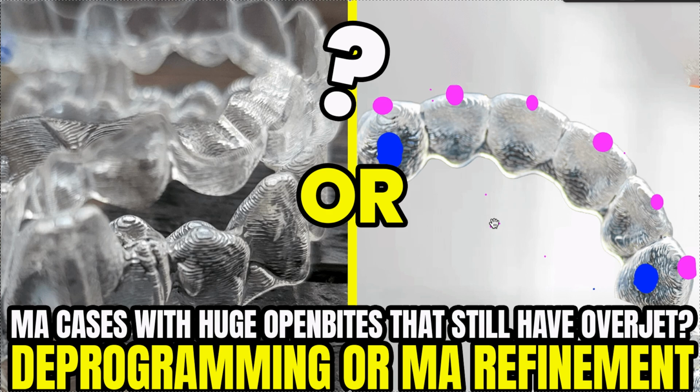And you end up with really strange bites if the patient is compliant. So I've got a lot of content on what I recommend doing about that. There's a few different options, and the same thing happens with Twin Blocks, so it's not a big deal. We just do deprogramming. We use Hawley retainers, we use bonded retainers. You can use cut Essix and keep an eye on them.